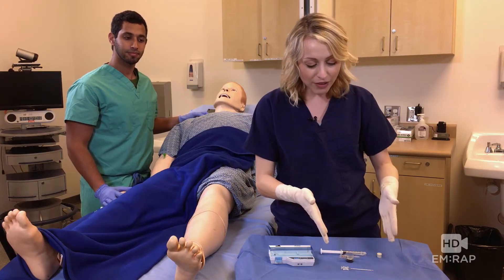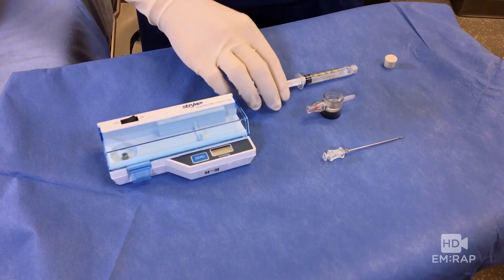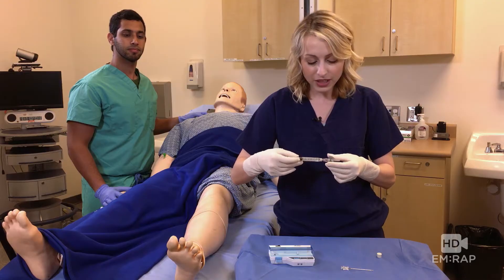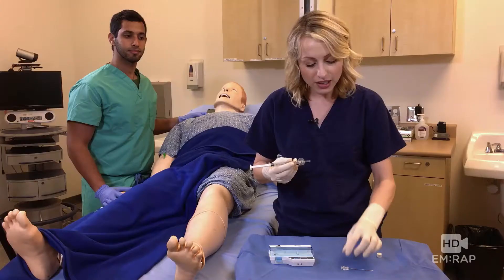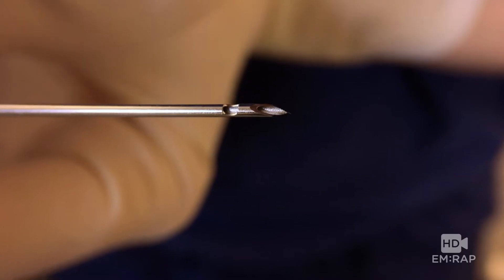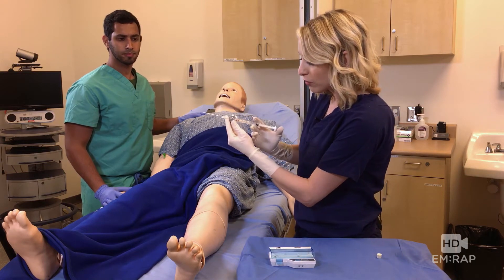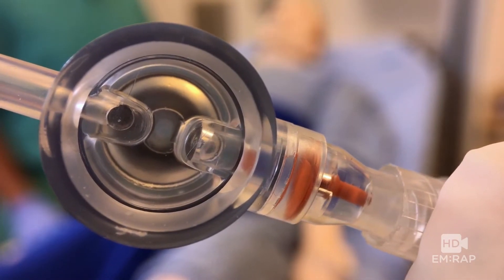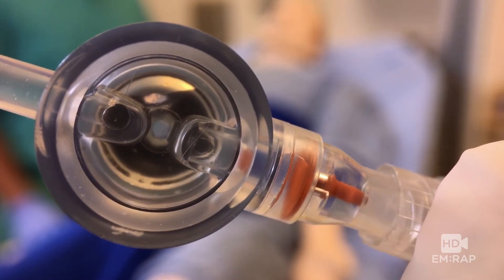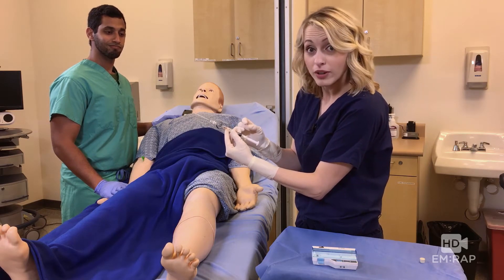To set it up, you have your sterile components: a three CC sterile saline syringe. You have the chamber and you're going to connect them thusly. Now you're going to connect the needle to the other side. The needle has a side port for measuring the pressures. We're going to clear out the air in the chamber by injecting the saline into the chamber — no air bubbles are allowed. You do this holding it at 45 degrees, and you may have to give it a little bit of an aggressive flick, like a subungual hematoma kind of flick.